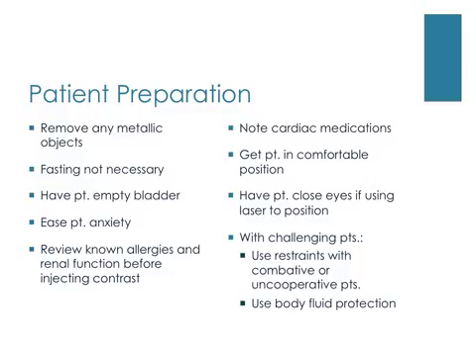You might find in CT that many patients confuse CT with MRI before they actually get into the room. They may be extremely anxiety-ridden or maybe nervous because they may think that they are going in a long tunnel, which is more claustrophobic for some patients than others. So you want to definitely make sure that you're explaining the exam properly to them and showing them the differences possibly between MRI and CT, and that this won't be too bad on their claustrophobia.